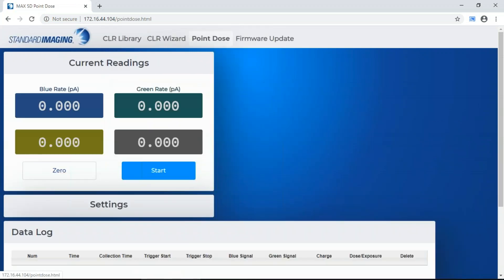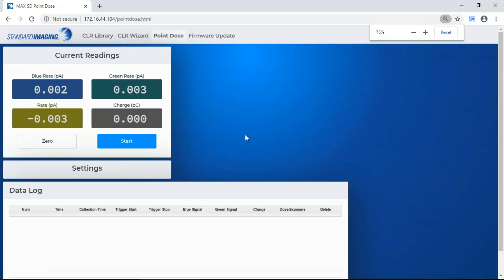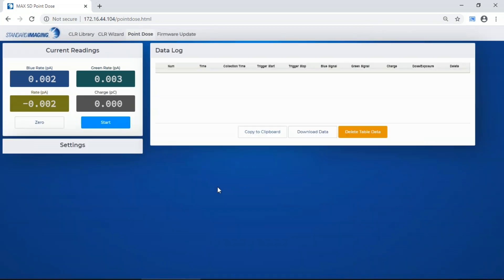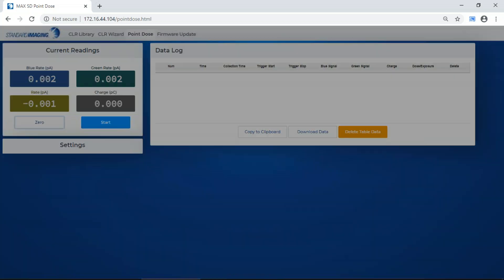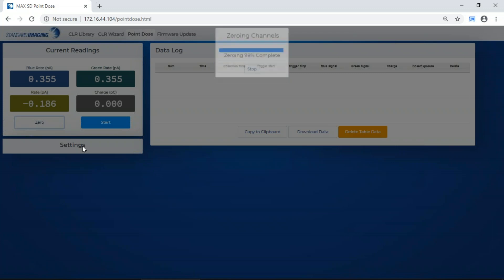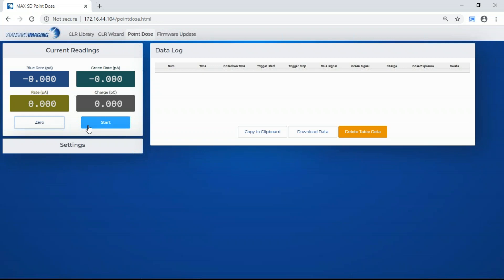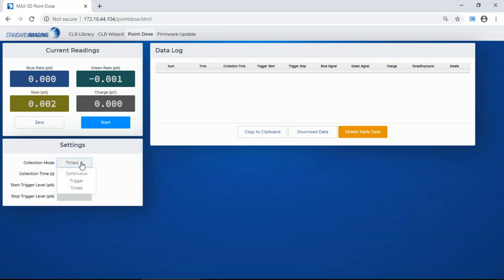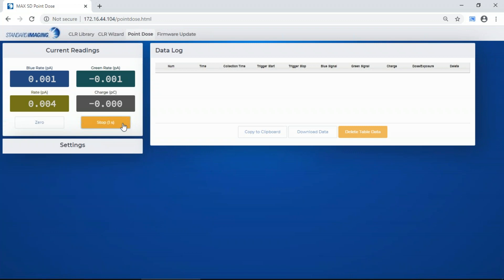If you want to do point dose measurements, you can also do that here. You can zero from here or on the device itself. It shows you raw values as well as corrected values. You can set your settings for timed, trigger, or continuous measurements and set your trigger levels. Start some measurements and it will give you raw data and corrected data.